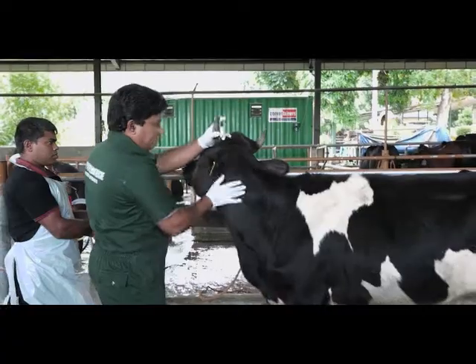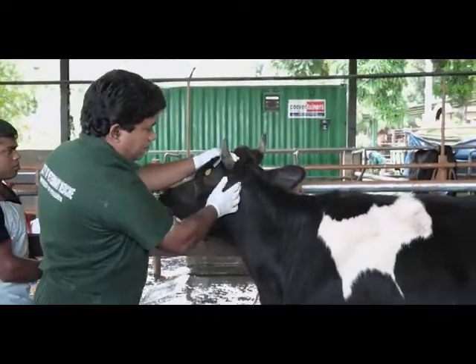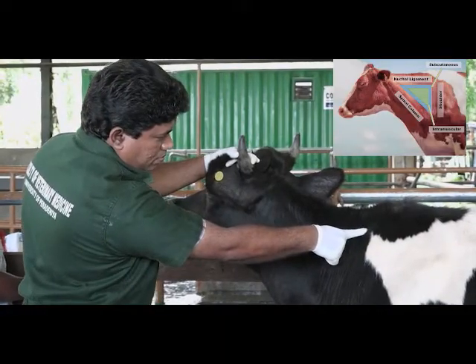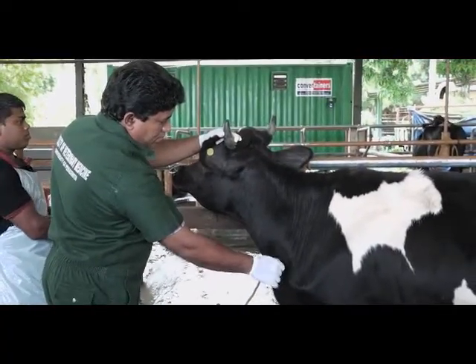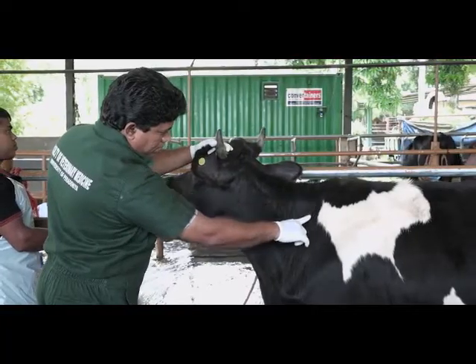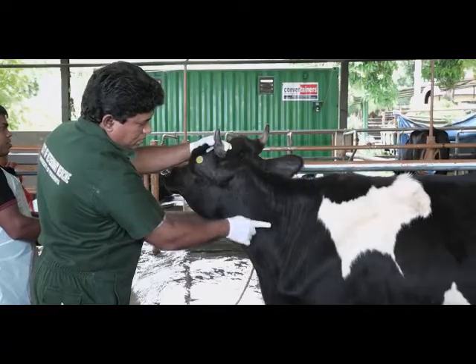In the neck region, IM injections are administered to the injection triangle. The vertices of this hypothetical triangle would be the base of the ear, cranial angle of the scapula, and the shoulder joint. This is the injection triangle of the neck region. Injections can be given within the triangle considering the volume of the injection.